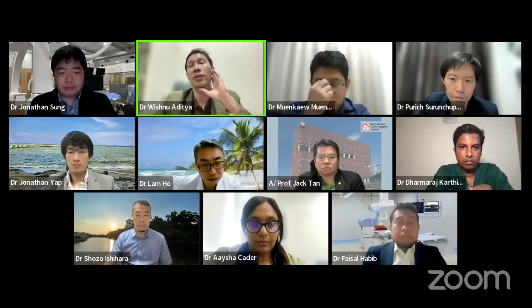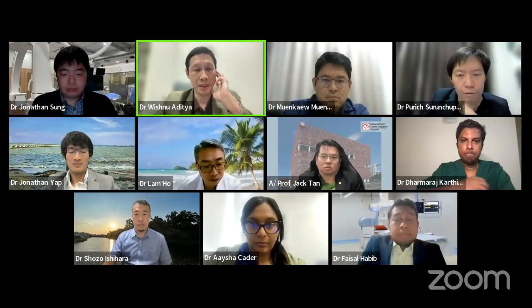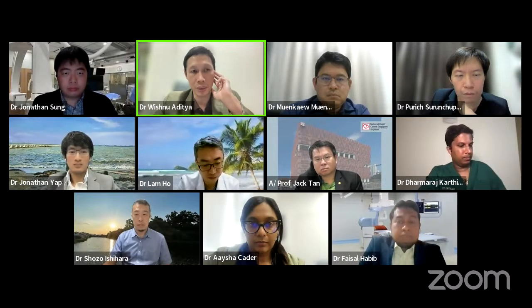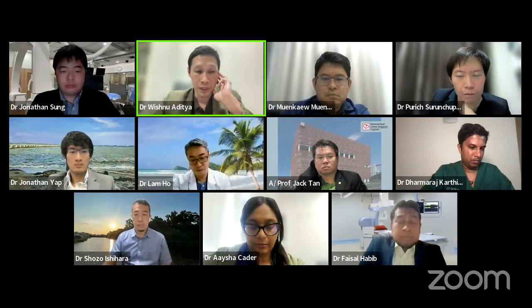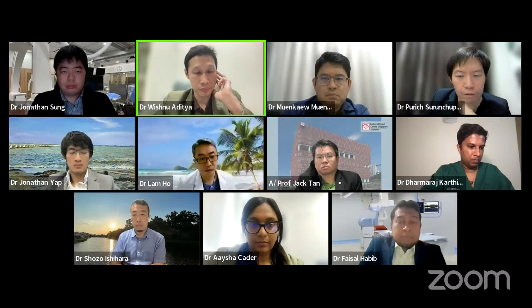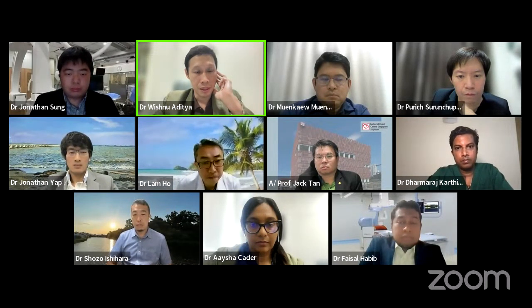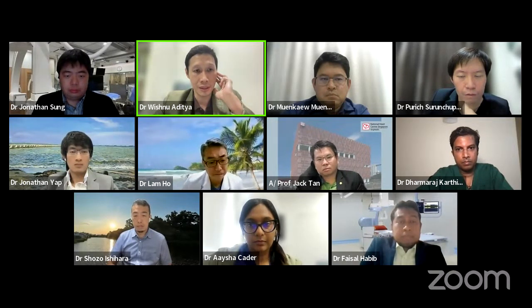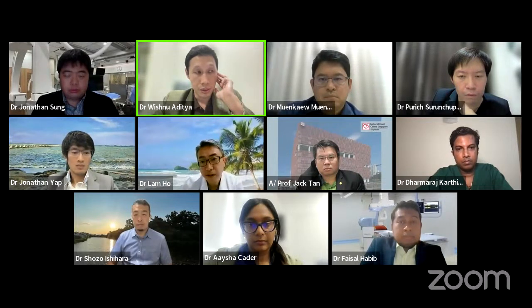Well, as you asked a philosophical question, and this topic is about Antegrade CTO, but really, I think the paradigm has already changed, and nowadays it's just about the strategy. So we don't really differentiate between Antegrade and retrograde CTO anymore. For example, whenever I see a good retrograde collateral, if it's possible, I always try to put a wire there. It's not necessarily a CTO wire, it usually just acts as a marker. But just by putting a wire there, it will efficiently reduce my contrast, reduce my radiation, and in my opinion, it really increases safety. And you will always have a backup plan if the Antegrade doesn't work. So I think you cannot differentiate them.